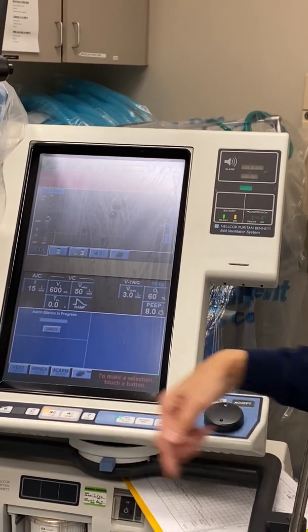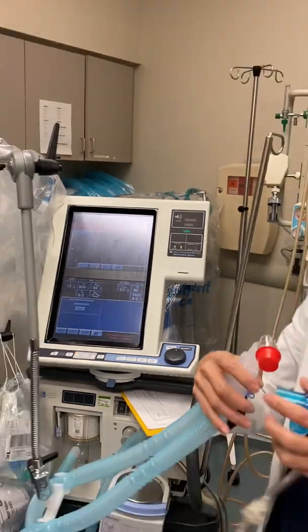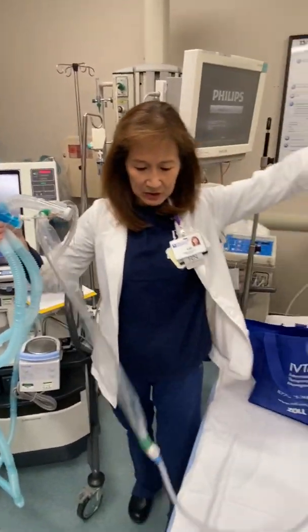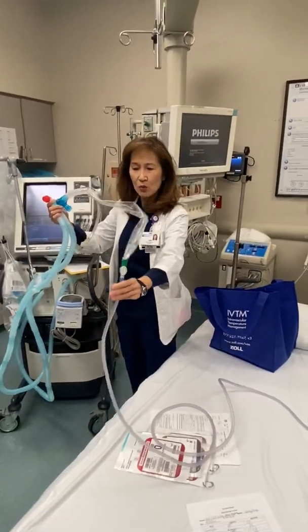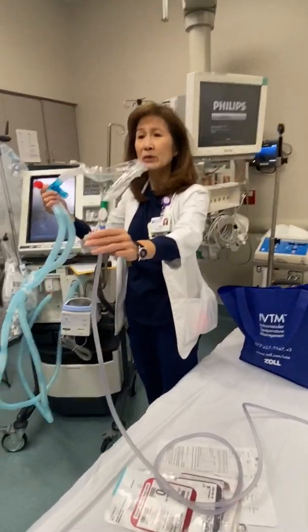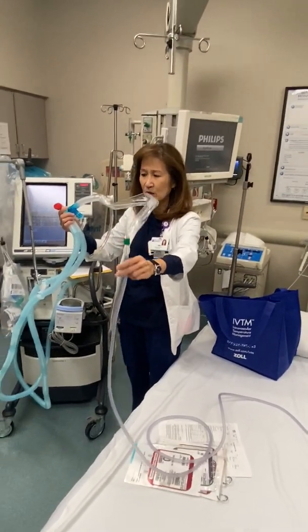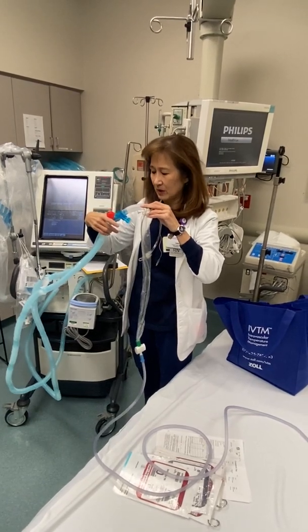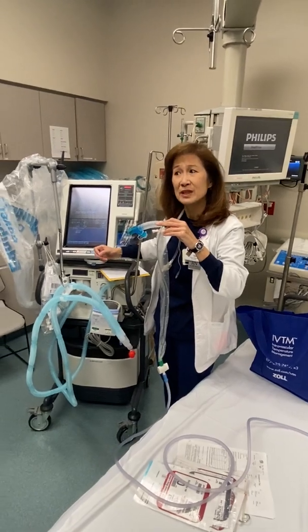Now, silence it again, 2 minutes. You want to go ahead and suction the patient. There is inline suction hooked up to your suction apparatus. It should always be set at 80 to 120 millimeters of mercury. So when you need to suction the patient, these are all hooked up. So all you need to do is give the patient 100% FiO2.